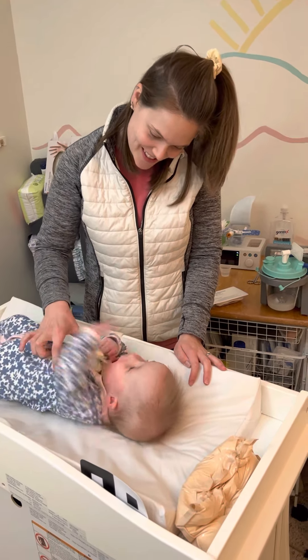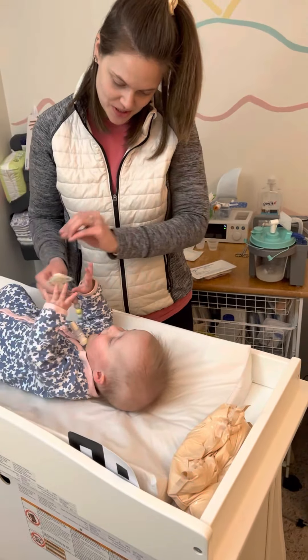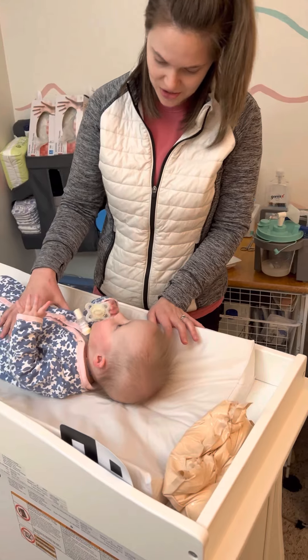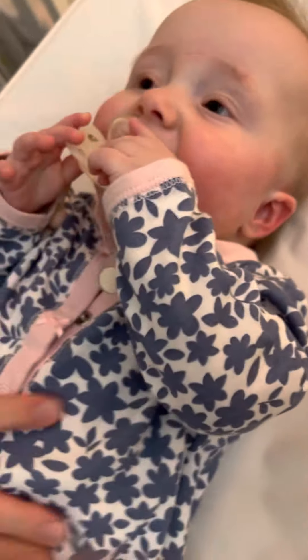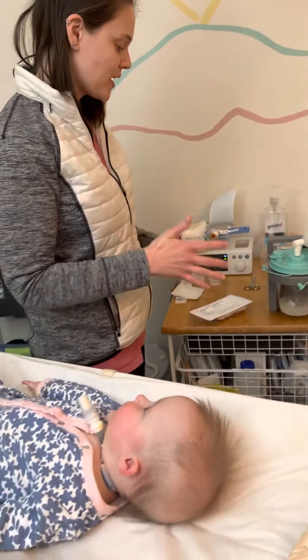We're going to learn how to suction Ziva girl. When you start hearing a rattly in her trach, that's when the secretions start to collect. She's pretty obvious when she needs to be suctioned — she'll get fidgety and you can hear it. You don't want to suction too often, but you definitely don't want her to have to work harder to breathe if she doesn't have a clear airway.